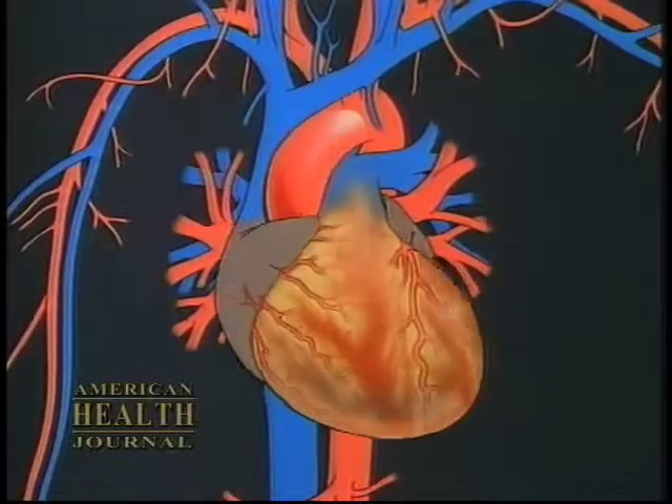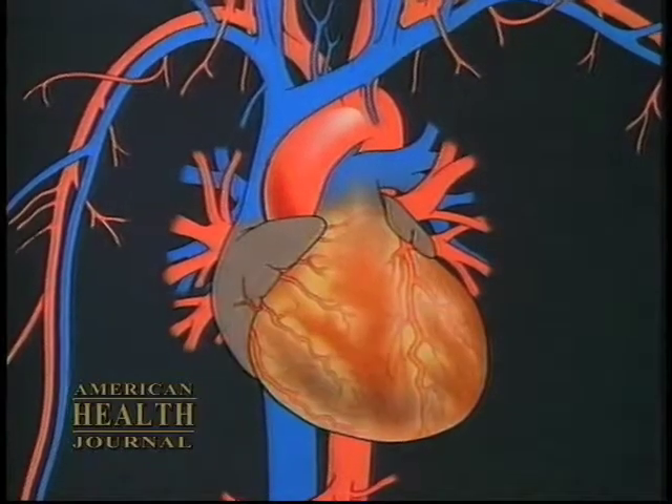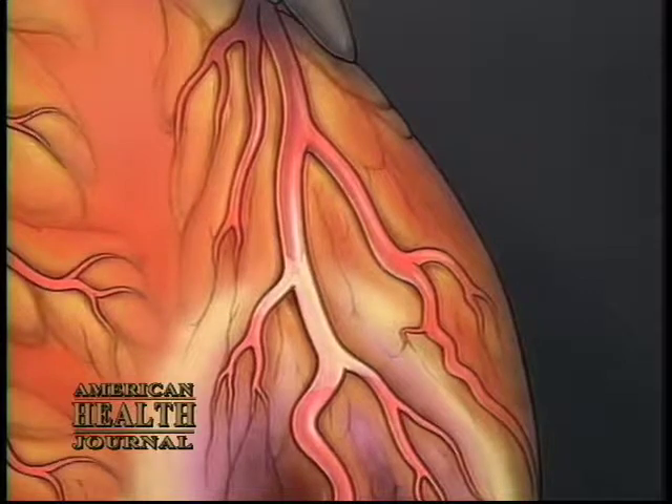The coronary arteries run on top of the heart, on the surface of the heart. So what we do is we expose those particular arteries and we bypass them right beyond the obstruction. We don't enter the heart itself — not like doing an aortic valve or a mitral valve — but we work on the surface of the heart, and by doing that we construct the bypass conduits.